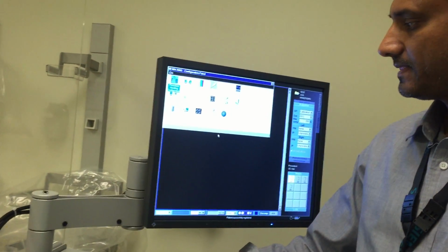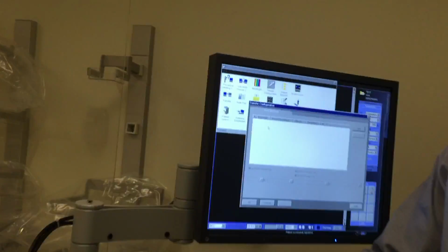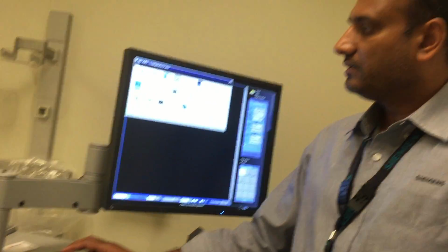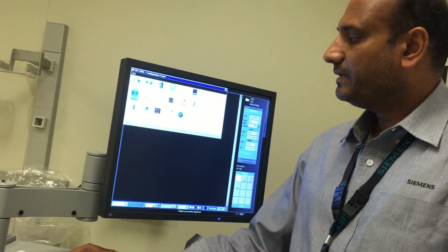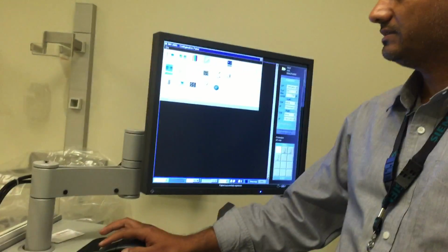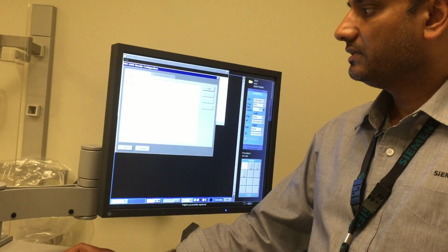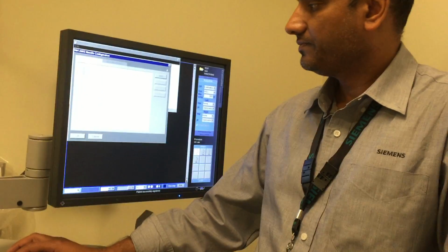All right. Wow, this is very interesting. So supposedly this clinic bought a certain type of needle. There are biopsy settings, of course. You can only use this type of needle all the time? It depends. You can add. They work initially with our apps, and then they usually add. Right. Those needles, okay. They have 13G needles. Okay. That's right. Or you can add, alright, okay, yes, they add. Okay.